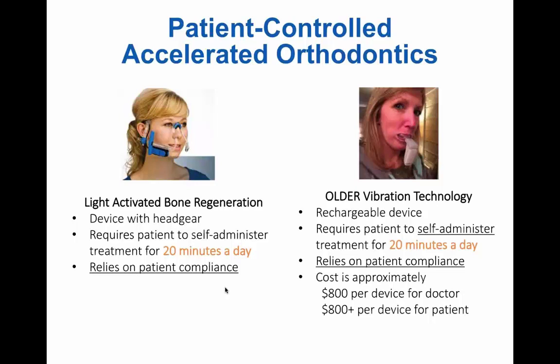It's light activated bone regeneration. These are patient-controlled movements. It requires the patient to self-administer the treatment for 20 minutes a day. Certainly relies, of course, on patient compliance, and you can see that that's quite a bit of an apparatus to put on the face there every single day for 20 minutes. Not sure if that's going to happen.